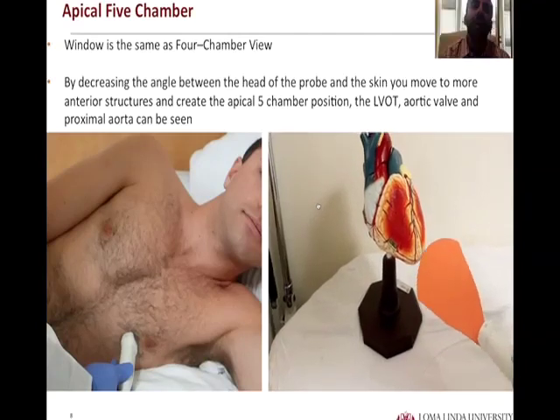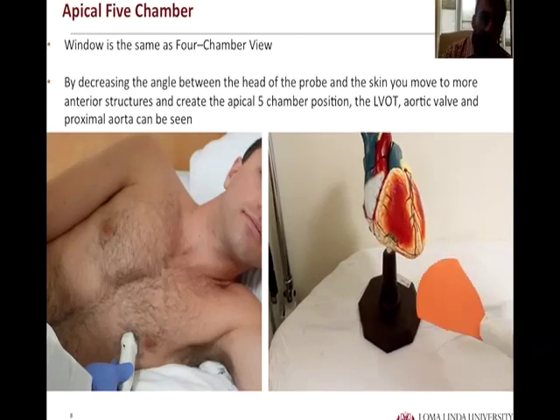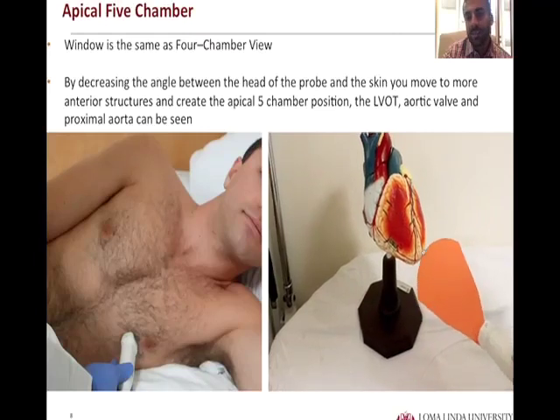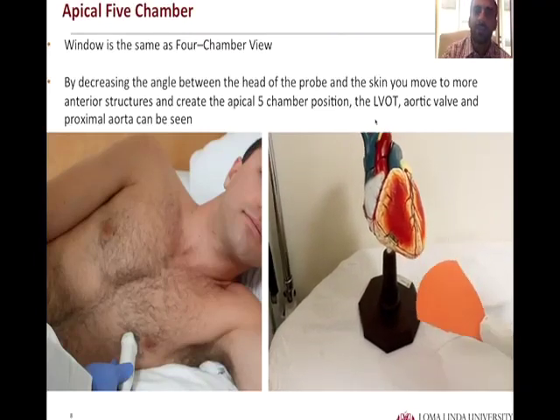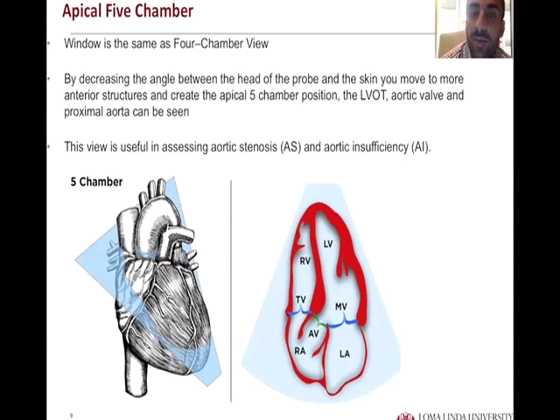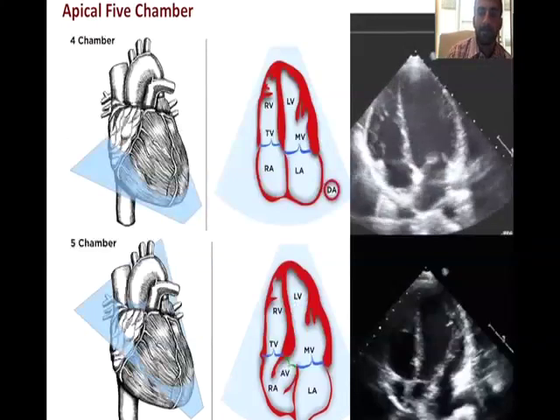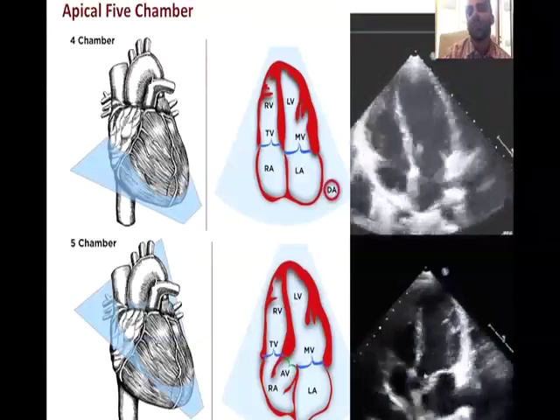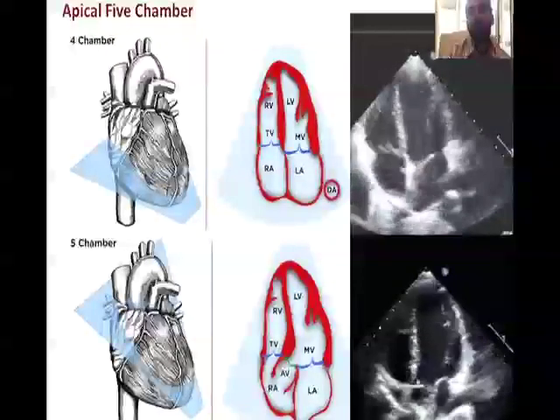Moving from the four-chamber view to the five-chamber view, we simply lower our angle with the ultrasound probe to the skin to allow us to insonate and see more anterior structures. This animation shows lowering the ultrasound angle with the skin to see more anterior structures. We are now able to identify the left ventricular outflow tract and aortic valve. This cartoon image shows the more anterior cross section, allowing us to see the LVOT and aortic valve — the ideal view to evaluate for aortic stenosis and aortic insufficiency.